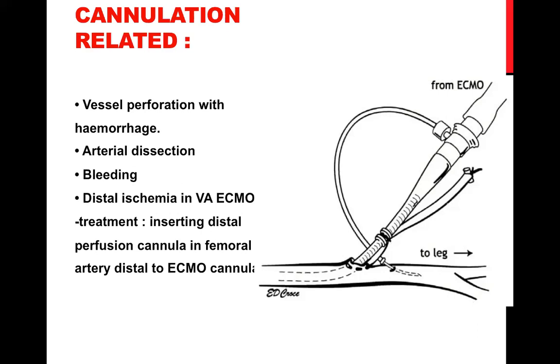That's a very good question, Haytham. You mentioned different schools, but I'll tell you what I follow and I'll explain why. In post cardiotomy shock, it's basically a cardiogenic shock due to various reasons, and you have to treat case by case. If you have a sternotomy, then why do you want to go and cut the femoral? So you always keep it in the sternum, and there are more benefits and advantages than disadvantages. You insert it centrally, number one, to avoid another incision and cutdown.